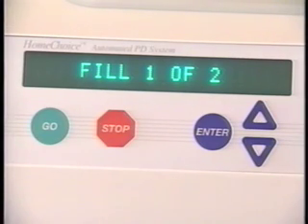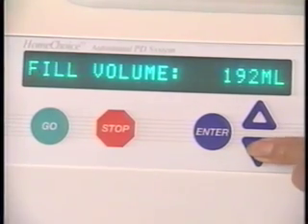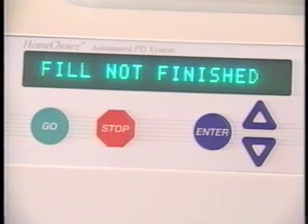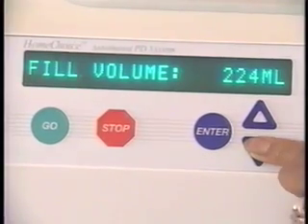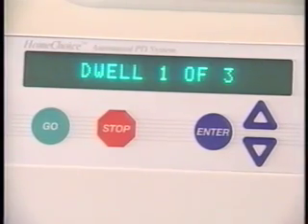To bypass a phase of treatment or an alarm when it is safe to do so, press stop. Press the down arrow until the display reads bypass. Press enter. The display shows the bypass condition and sounds a warning alarm. To complete the bypass, press stop. Then press the down arrow until the display reads bypass again. Press enter, and the machine will continue with the next phase of therapy.